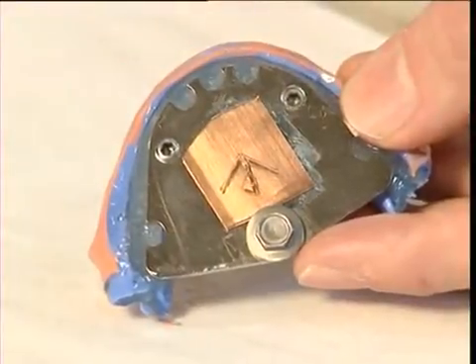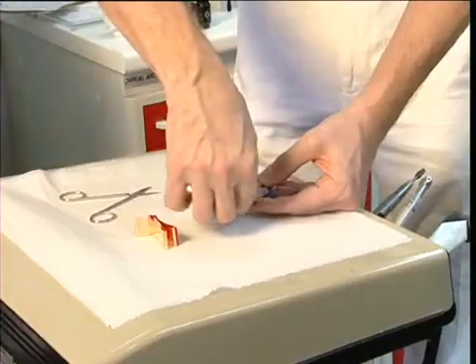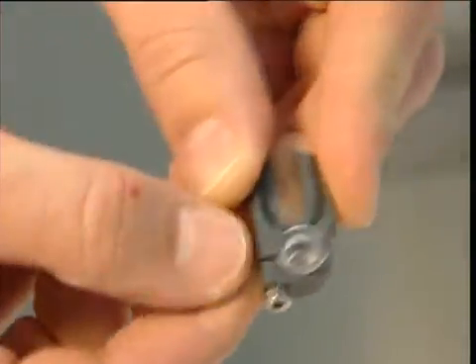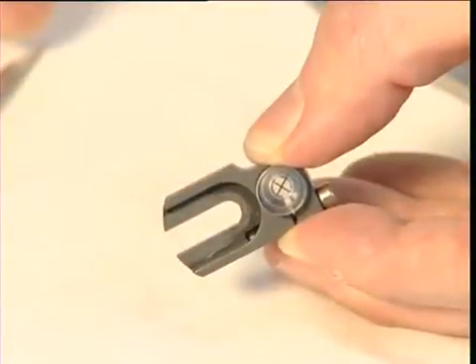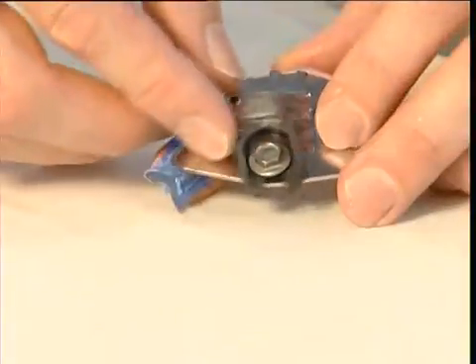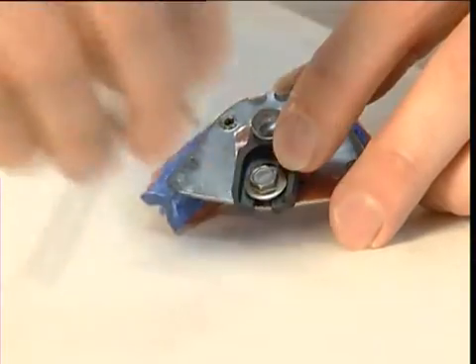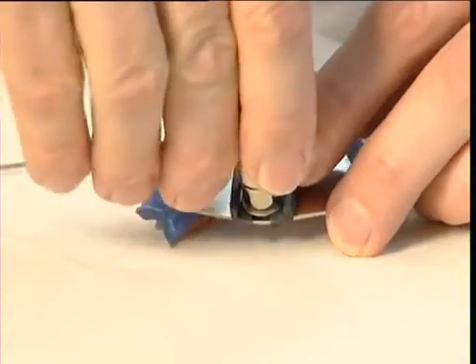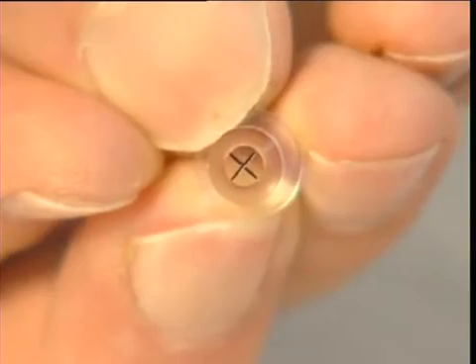The lower tray is then removed. The Gothic arch on the foil provides information about the functional symptoms, and in patients without pathologic findings, the tip of the arch denotes the centric relation. The sighting device, which is inserted into the tracing ball holder on the alignment clamp, is then used to align the tip of the arch. The clamp is locked with a large hexagon screw and the sighting device removed.